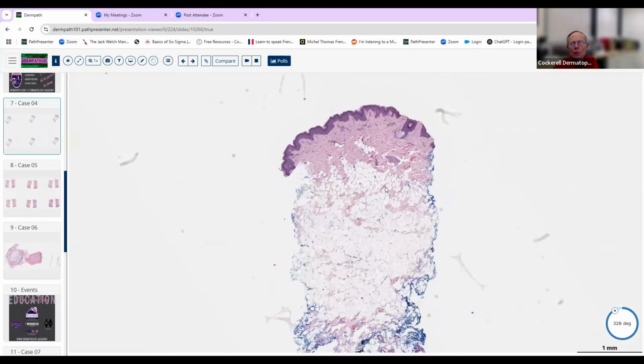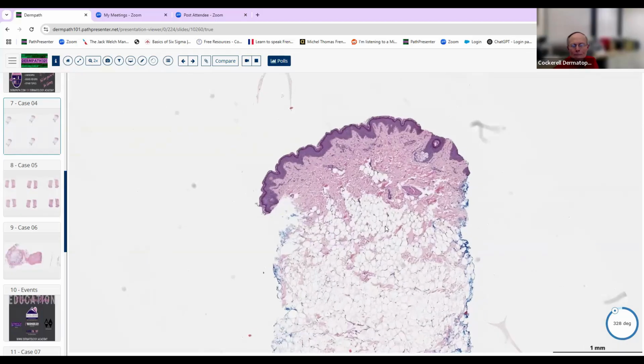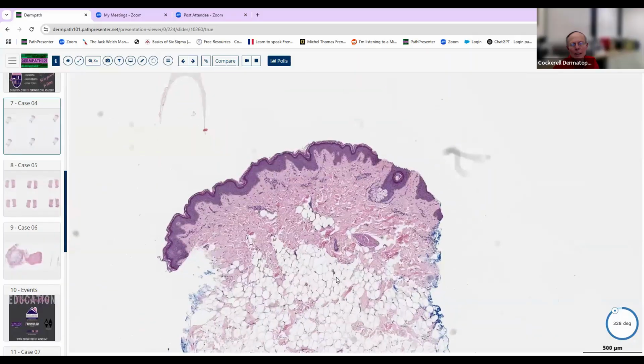The other thing that you would think about is focal dermal hypoplasia, or Goltz syndrome. That's where the fat occurs high up in the dermis. Usually it's up in this part of the dermis. So it's not just at the bottom, it's usually all the way through. And you can get some other abnormalities there too, some abnormal follicles or diminished follicles associated with that. But we can be concerned about some kind of a hamartoma here. And you can see that there is a little bit of reticular dermal collagen left here, and then really minimal other change.